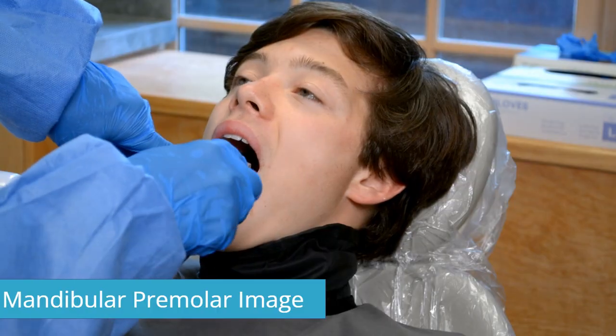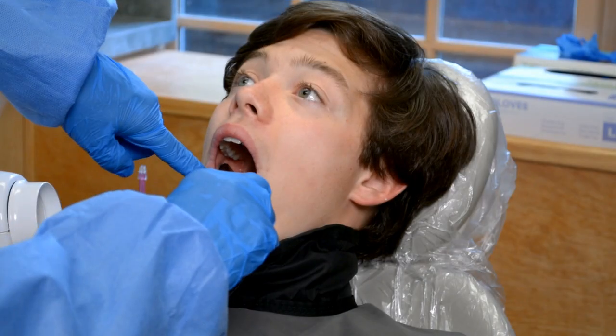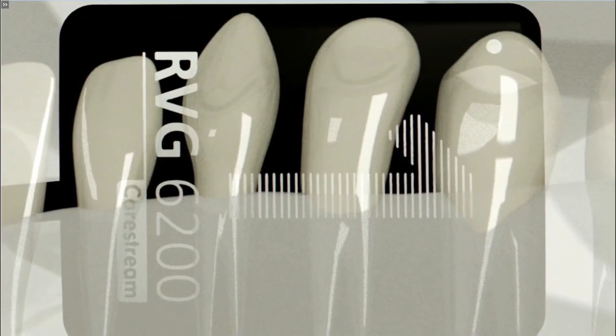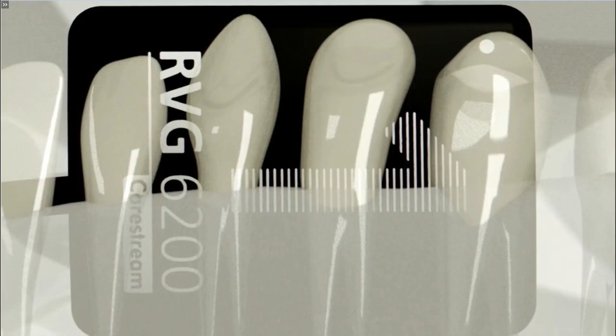Mandibular premolar image. To acquire a mandibular premolar image, place the sensor in a more anterior position than it was for the molar image, in a sweeping motion. Position the sensor between the tongue and the teeth, and use the rigidity of the sensor to push the tongue out of the way. Place the sensor as close to the patient's midline as possible. Position the sensor parallel to the long axis of the teeth, and verify the horizontal placement.